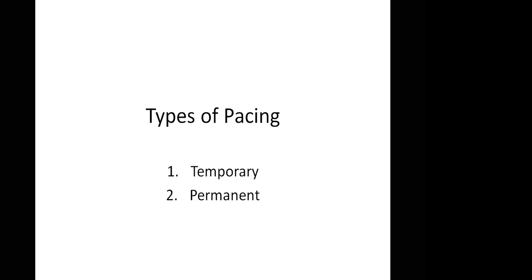Yeah. There's a reason why I'm trying to point us to that. On the topmost part of that machine itself, you see dual chamber, but I want you to focus on the machine itself now. You will see two dots on the top part of that machine, two on both sides.